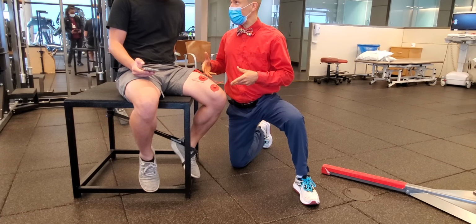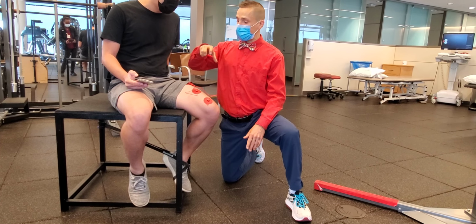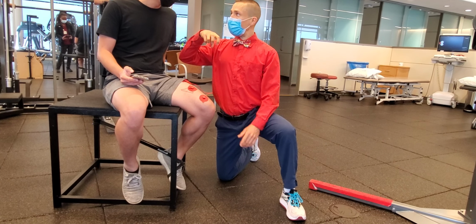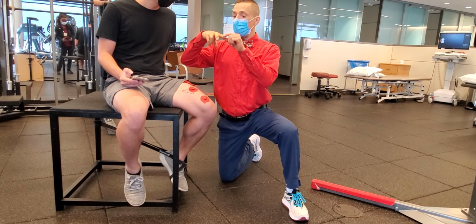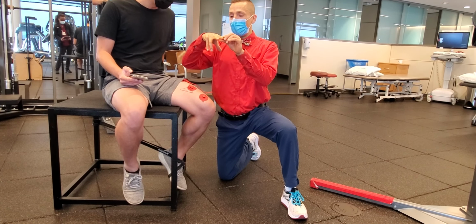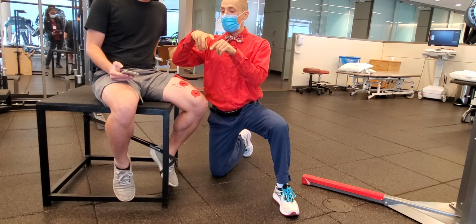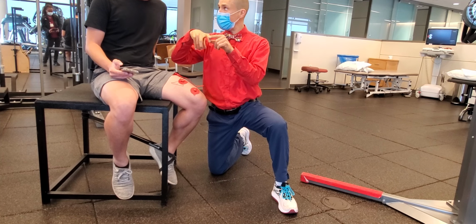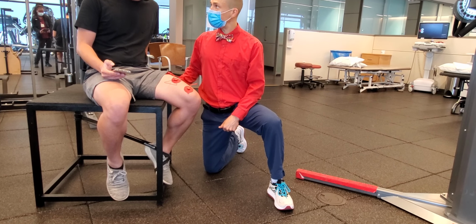It would be very exhausting for you. Another strategy when you don't have the manual resistance of me is that you can put sufficient weight on the knee extension, kick out with two, preferentially using the left leg, and then take the right one off so it's an overload where you're trying to kick out against the resistance, but you're failing, similar to how you're doing here with the manual.